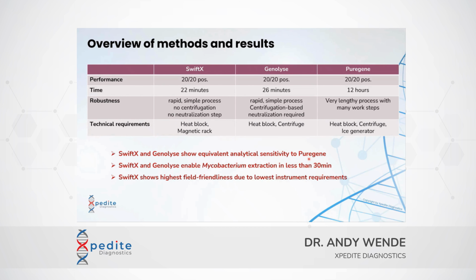And that basically concludes that these SwiftX extraction approaches, as was also described by Insaf, are really a field-friendly and point-of-care suitable method in themselves, which can then be coupled with different analytical methods like LAMP, like RPA, but also everything else.